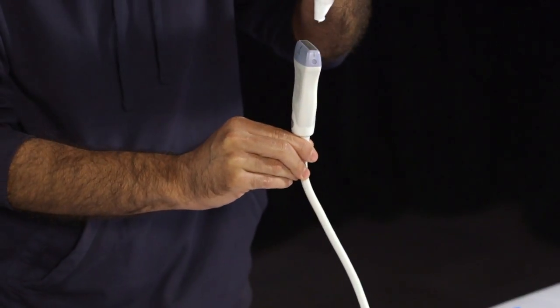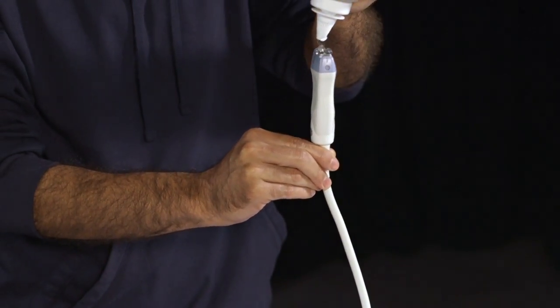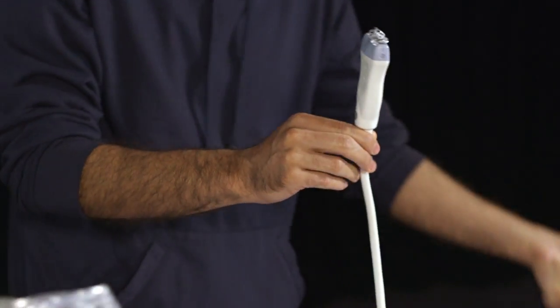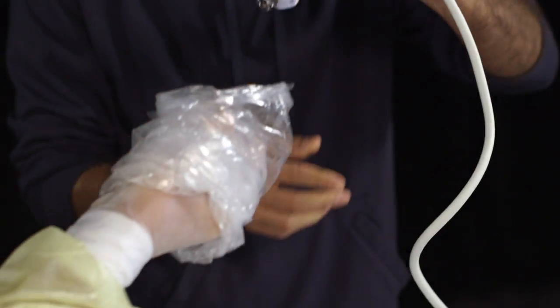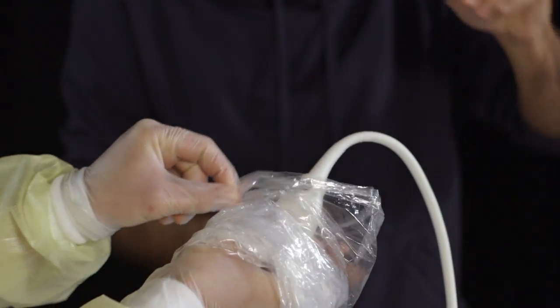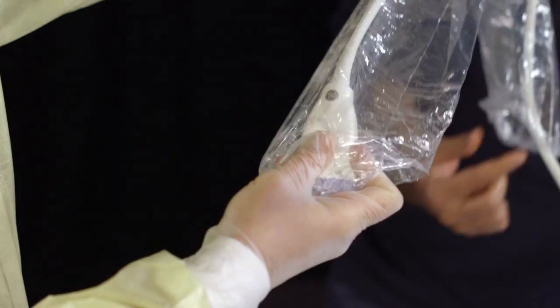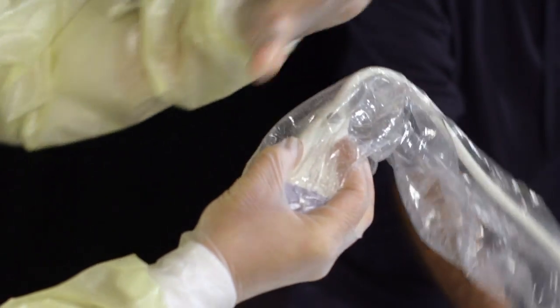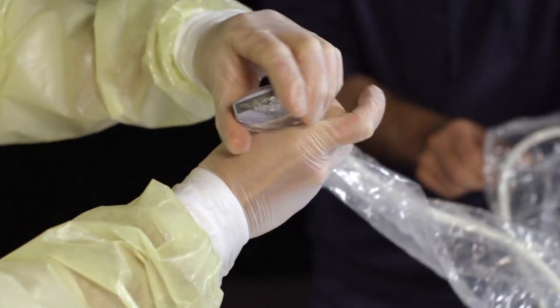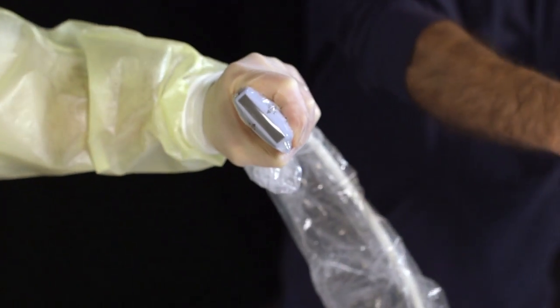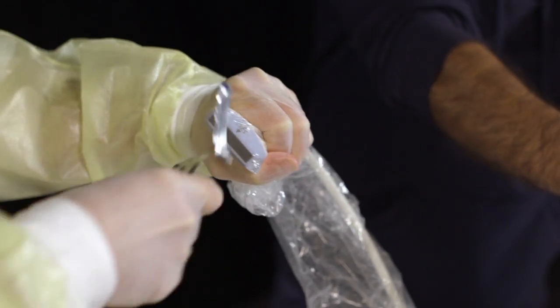You might need an assistant to help you apply the sterile probe cover. Have your assistant place gel on the probe and then help you place the probe inside the sterile cover. Remember to remove any air bubbles caught under the cover. Apply sterile gel to the outside of the probe cover.